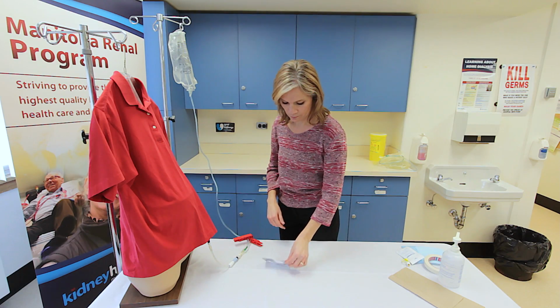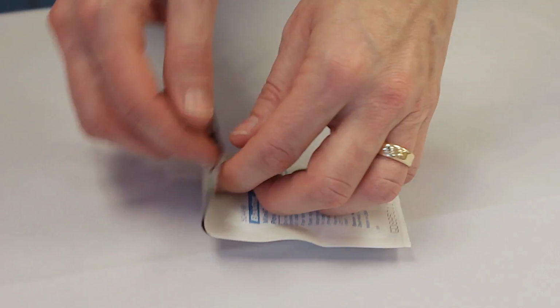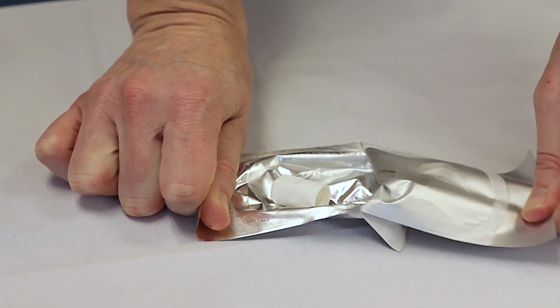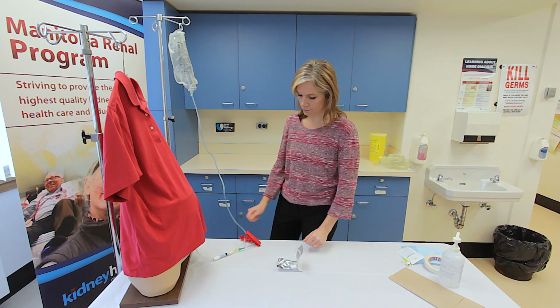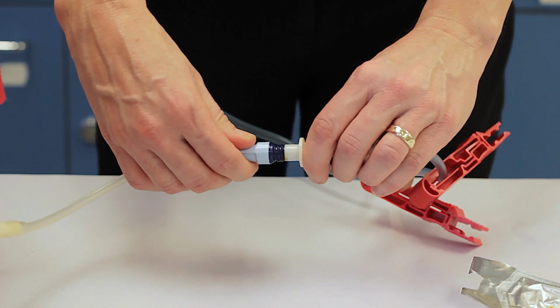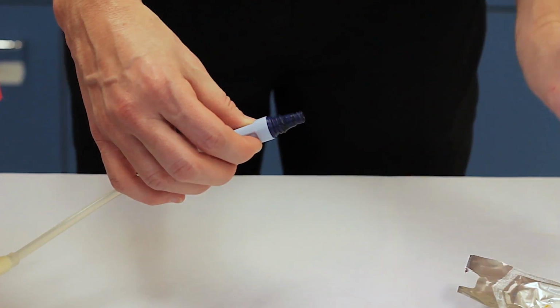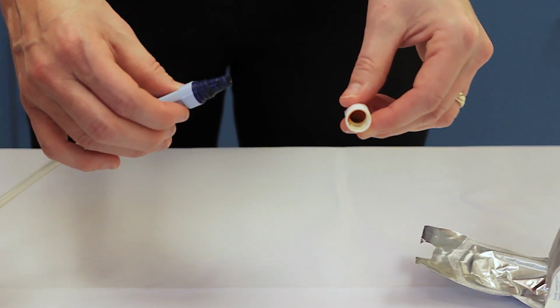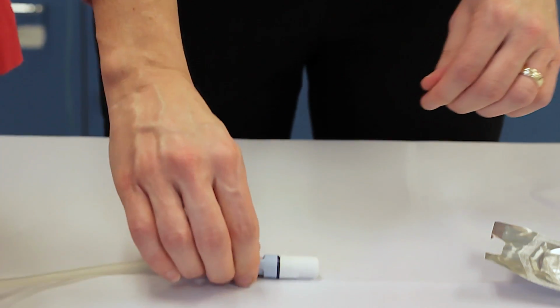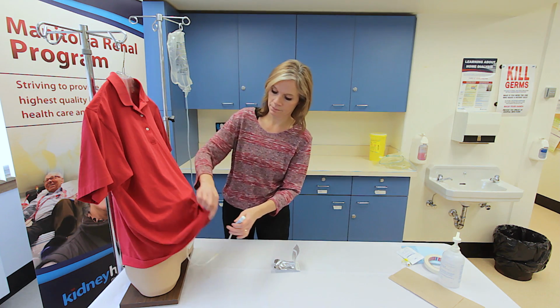Open the mini cap package with the foil side down so that the cap does not roll off the surface. Position yourself to avoid crossing arms when making a sterile connection. Maintaining sterility of the transfer set end, disconnect the dialysate solution lines from the transfer set and apply the sterile mini cap. Immobilize the transfer set to prevent trauma and infection to the exit site.